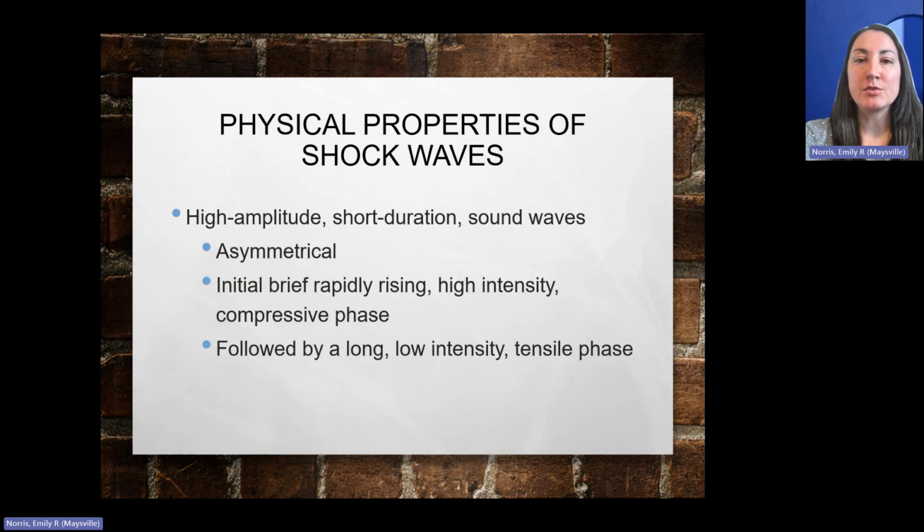So, they are high amplitude, short duration sound waves, asymmetrical, with an initial brief, rapidly rising, high intensity compressive phase that's followed by a long, low intensity tensile phase. So, there's like a quick burst and then a slowing down of that wave in the transducer before it hits the skin.